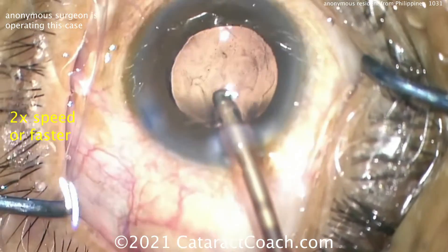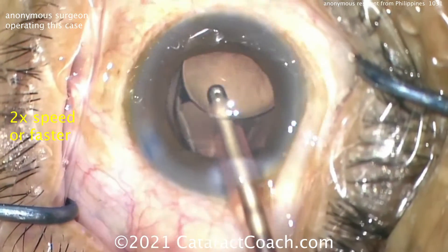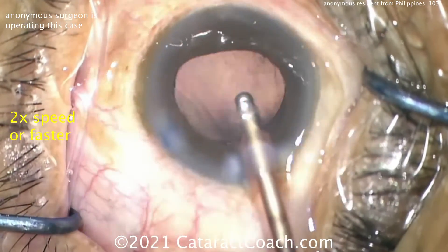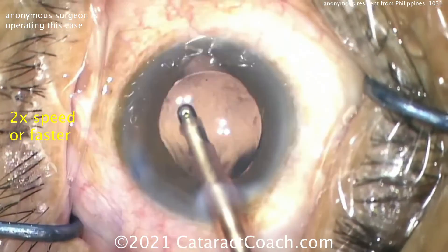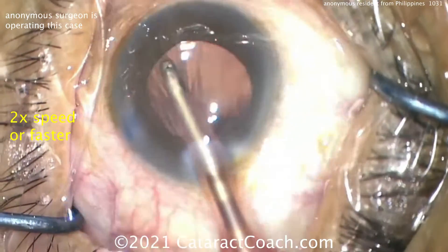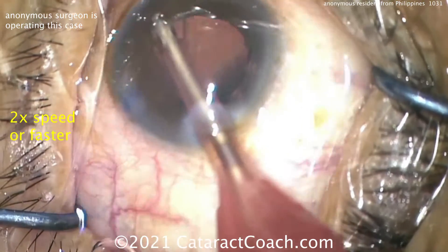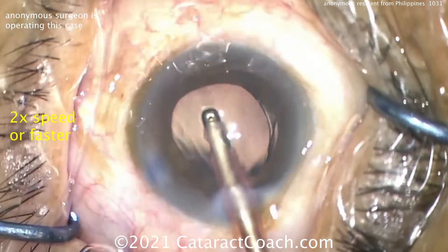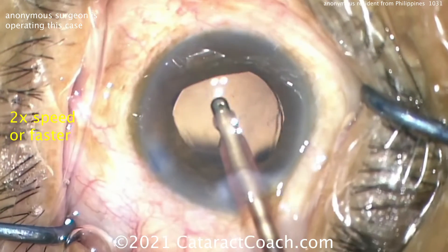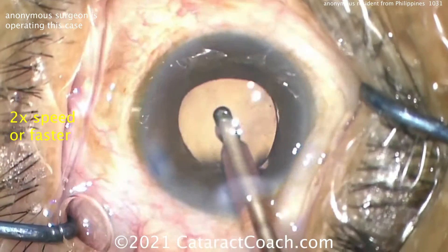IA to remove the viscoelastic — aspirating behind the lens, that's good. Remember, if you rotated the lens a little more you wouldn't have a haptic pushing up against the bag. I like to rotate the haptics about 90 degrees away from where the incision is — it makes it much easier to get under the optic to remove viscoelastic. The capsulorhexis was a little generous; I'm not sure it fully overlaps the optic, but this patient will have a beautiful result.